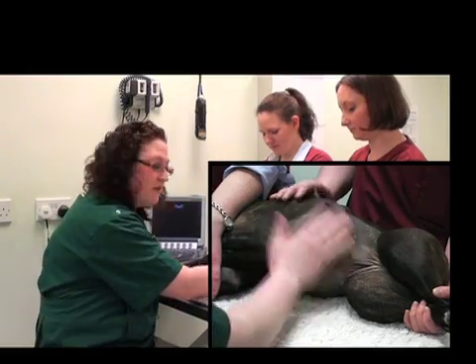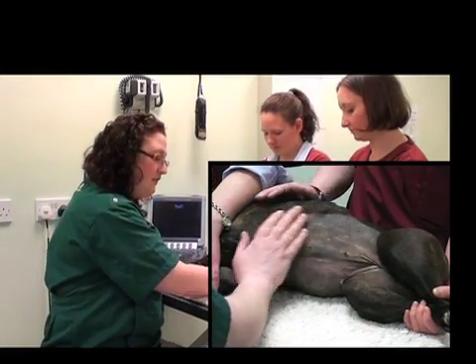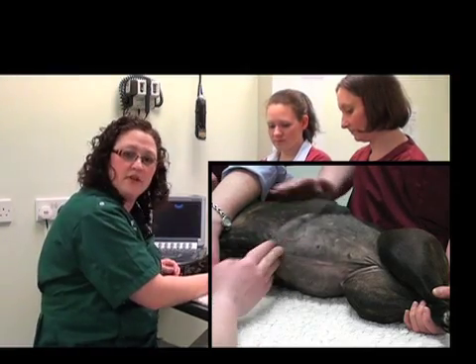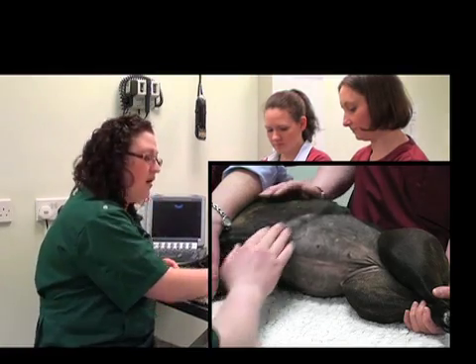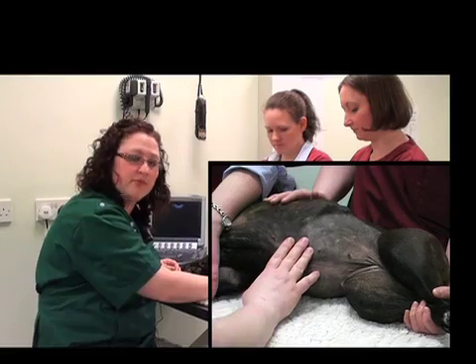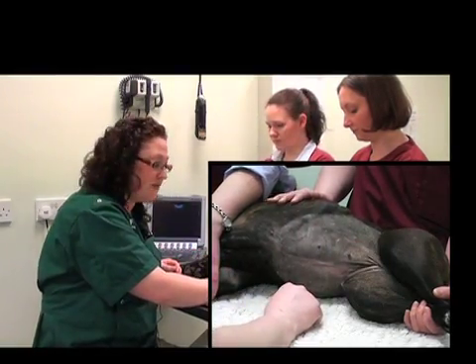So what you can do is ensure that you clip a nice large area. When performing a full ultrasound examination of the abdomen, you'll want to continue your clip all the way cranially past the xiphisternum, along the rib cage, and actually halfway up the side of the ribs on the lateral side, and all the way caudally to include the urinary bladder.